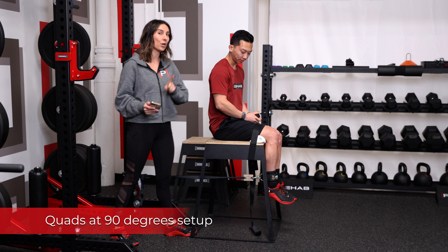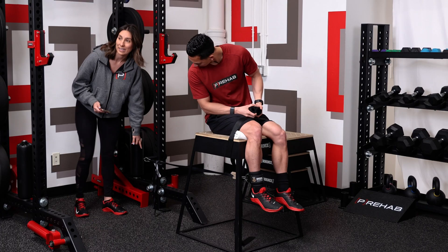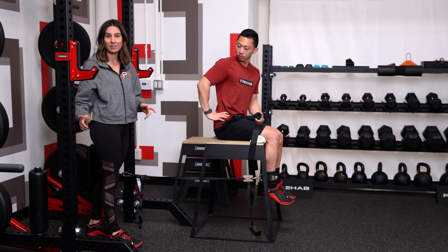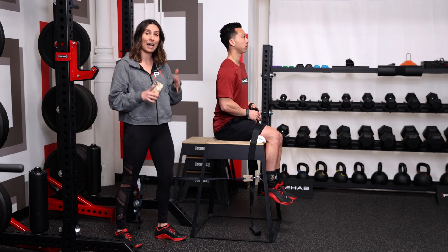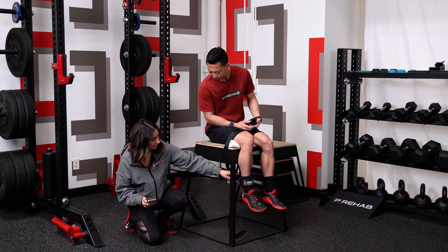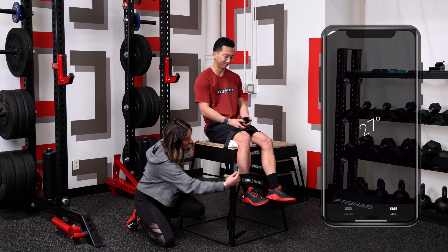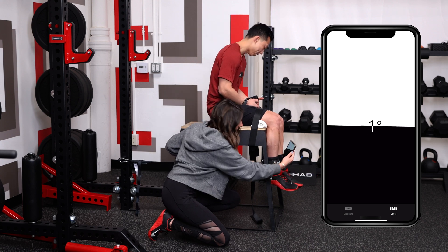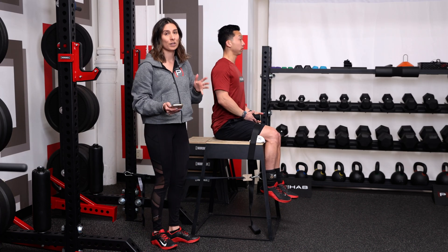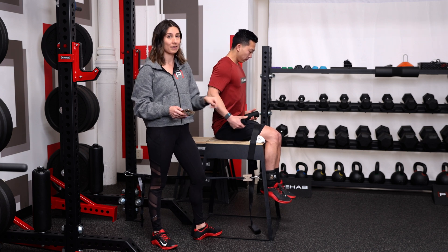Now let's go over the 90-degree quad setup. This is more feasible for the average clinic because the anchor point is a bit higher, so if you don't have access to a squat rack with bottom pegs, this is really easy to set up. You can also use a treatment table, a high-low, or plinth table. We set this up so the line of pull where it meets the tibia is also 90 degrees, and we use the Level app to verify — at zero degrees on the app, he's at a 90-degree knee angle. The only difference is that normative data may not apply at 90 degrees, but we're focused on reliability here.